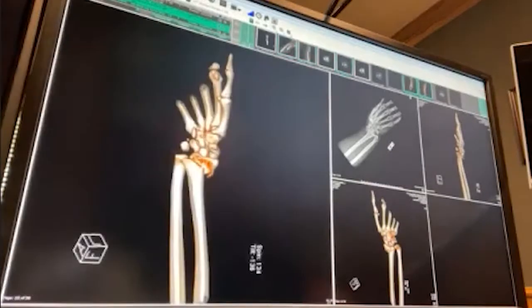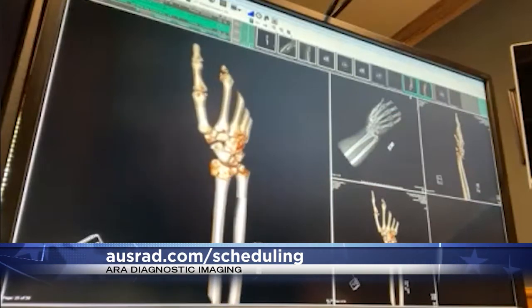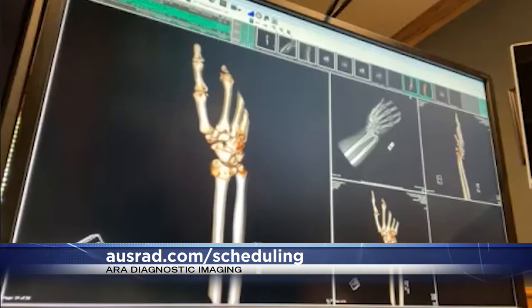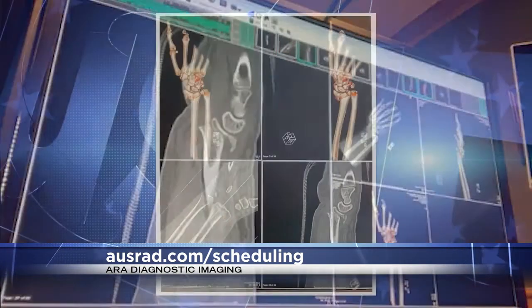This person had a pretty good radius fracture, so their distal arm right before their wrist here. So this piece should be on here, and you can see that it's actually pushed down and it's back to the back. So we call that displaced and impacted. And here's just what the normal CT looks like from the side. So you can see the fracture.